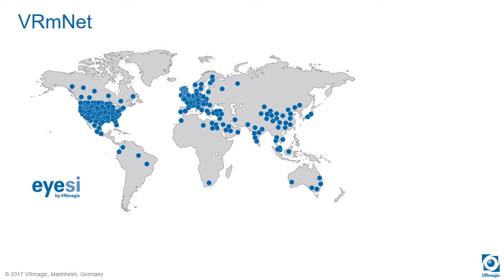Yeah, that shows where our simulators are currently used. As you can see, we have covered, for example, the US almost completely. We have 90% of all residency programs in ophthalmology equipped with our simulations. We have covered large parts of Europe. In England, we have covered, I think, all training programs that are there.